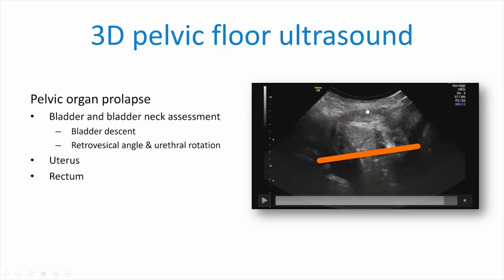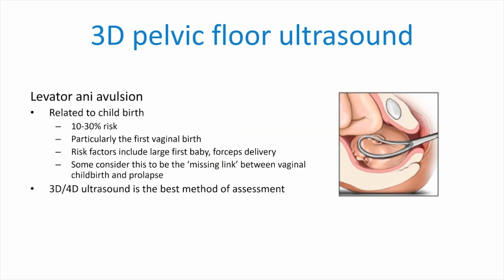And enteroceles can be very difficult to diagnose, and rather than guessing what is going on by using this ultrasound, we're actually looking in there and seeing exactly what's going on with the organs of the pelvis in relation to the pelvic floor. The other thing we do is we look directly at the levator ani muscle. So the levator ani is that important part of the pelvic floor because it forms the sling around the hiatus, if you like.